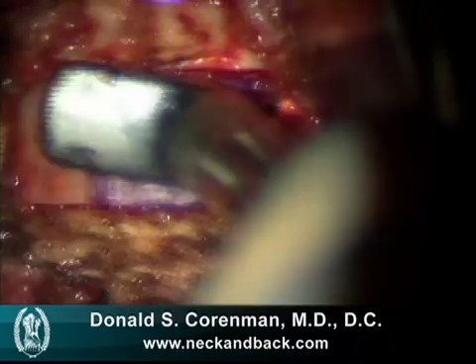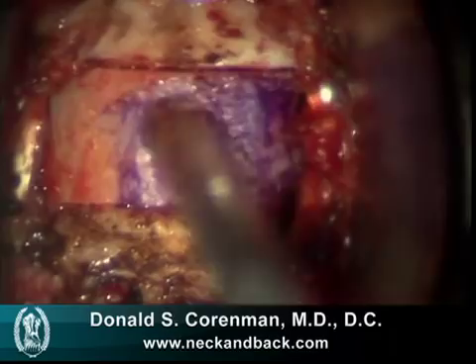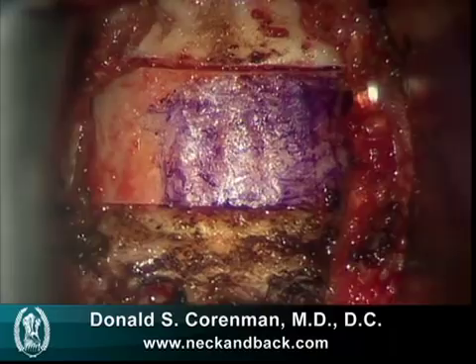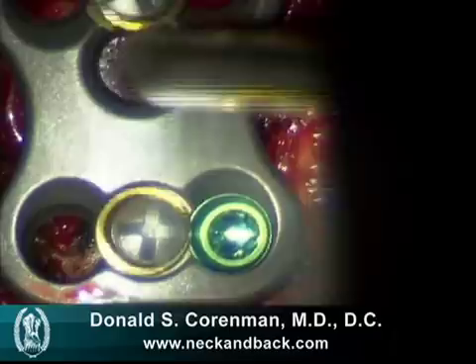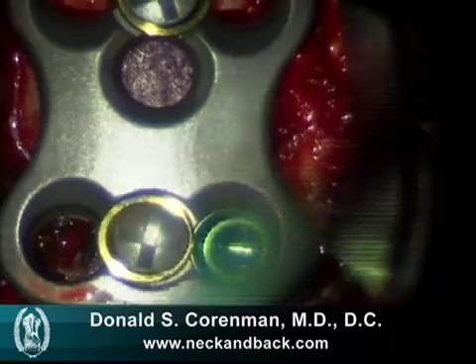We then take a small titanium plate, and that plate will be put on the front to cover this graft, to stabilize it, and to allow the patient to get out of a collar much more quickly than normally. These green screws that you see look to be quite big, but they're actually small — there's significant magnification from the microscope that makes these screws look larger than they really are.